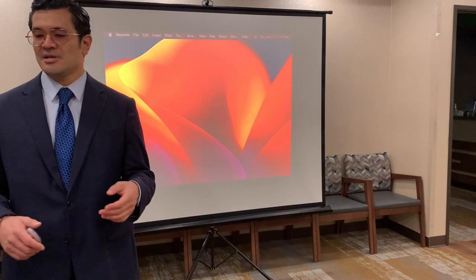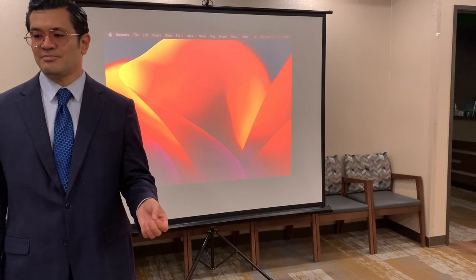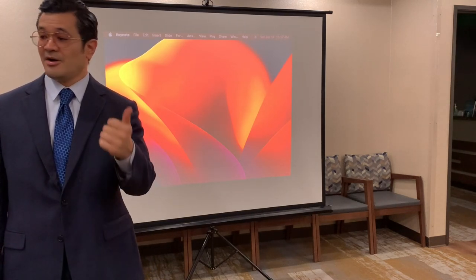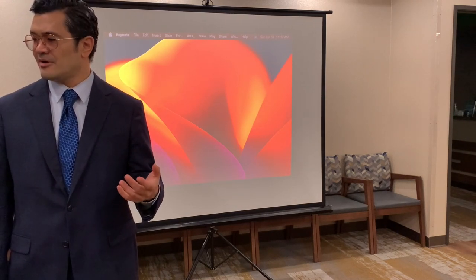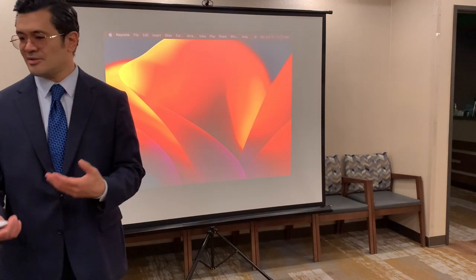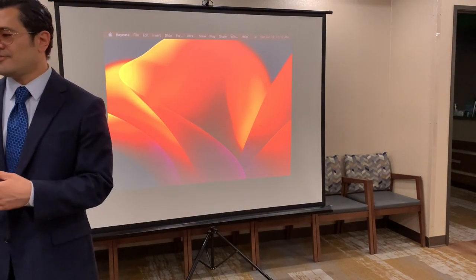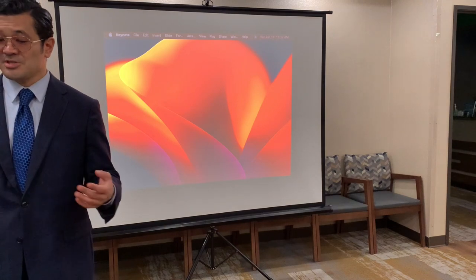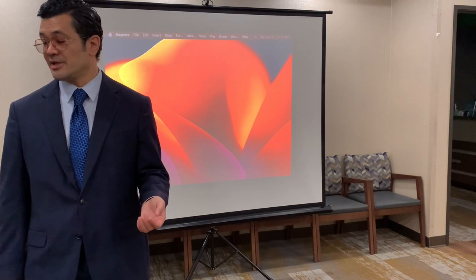There's no prism lens. So if you have a prism patient, they are guaranteed to need the prism in spectacles after surgery, in which case we're going to choose either a monofocal or a toric type lens to give their vision a little bit better improvement. But regardless, they're still going to need prism afterwards, because we can't do a prism implant. So on those patients, we stay far away from any multifocal lens. It causes problems. And a lot of the patients with prism also have amblyopia, and if you remember, that's a relative contraindication for a multifocal lens.